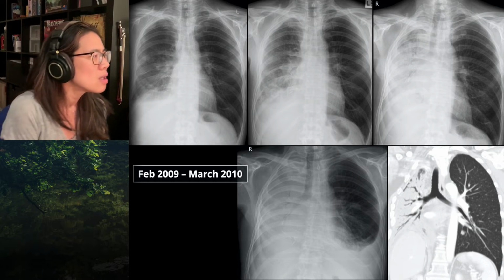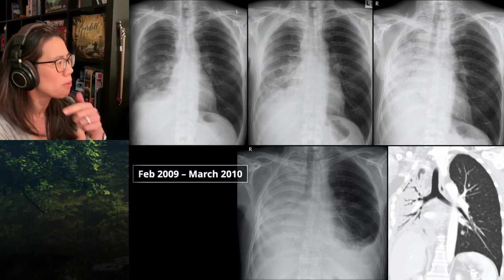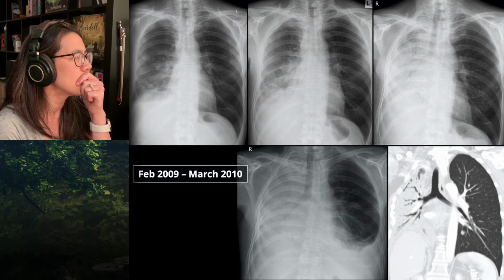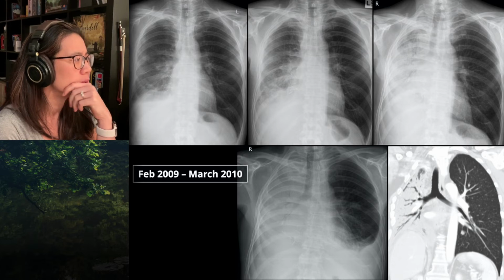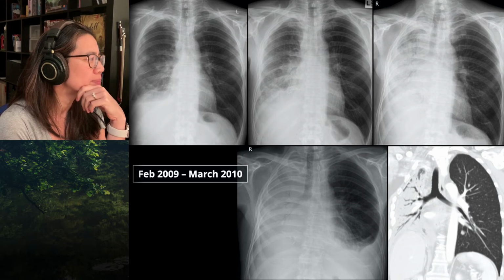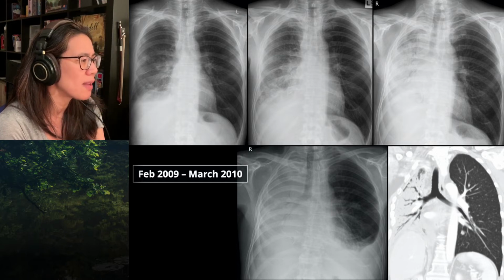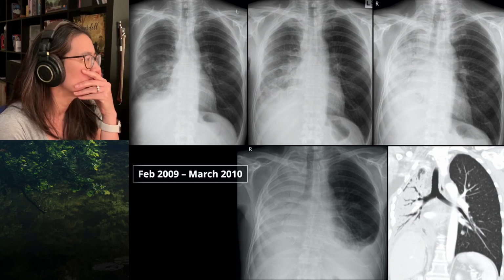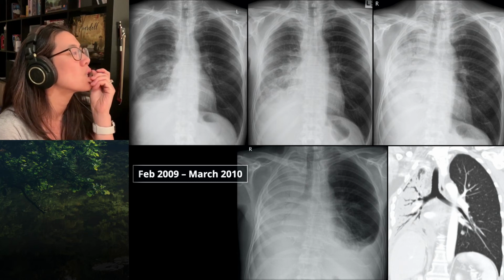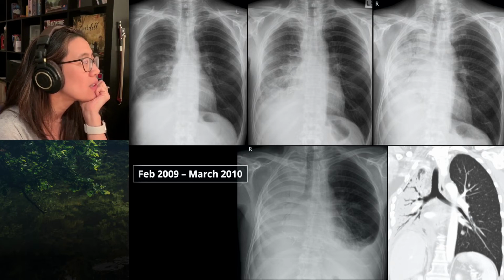So what are you thinking there? Some sort of pleural process. So you describe rounded densities in the pleural space and loss of volume. What might that be? TB until proven otherwise. No. Try again. Previous trauma. No. I wanted to say asbestos, like a mesothelioma, but I don't see evidence of asbestos plaques elsewhere. You don't have to have asbestos exposure to get a mesothelioma. This was a mesothelioma. He has had that, surgical clips were. So he's had a fair bit of the tumour resected.